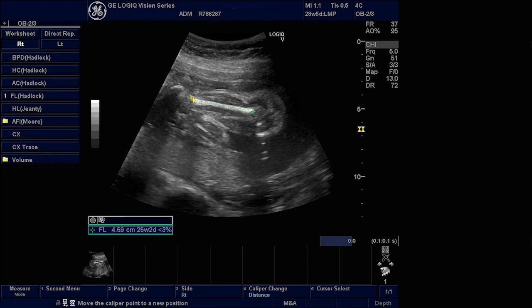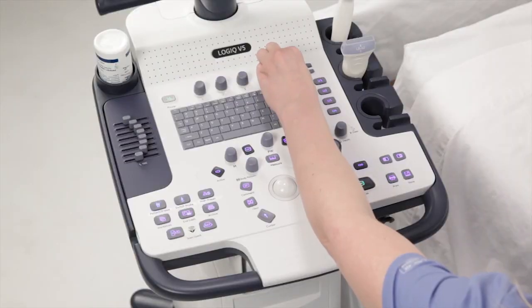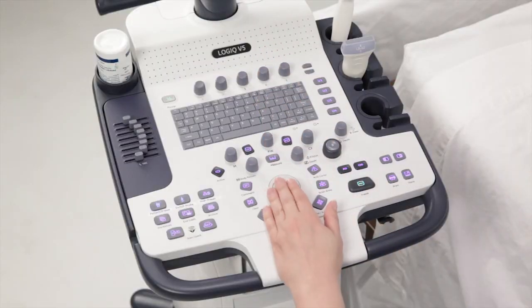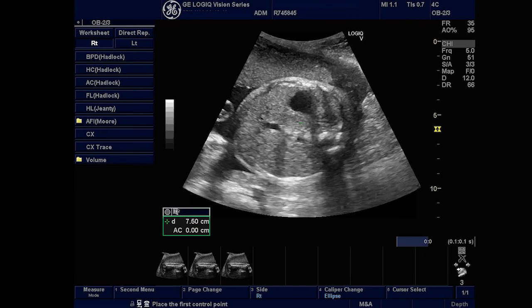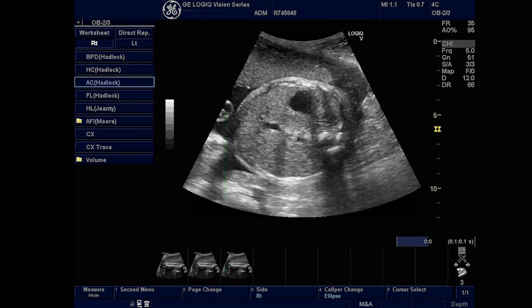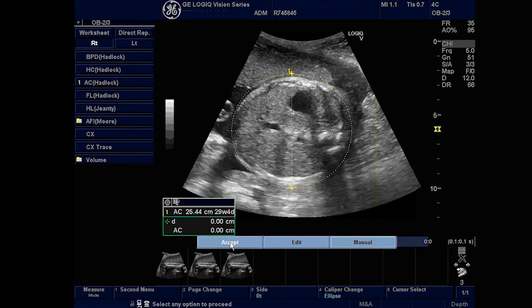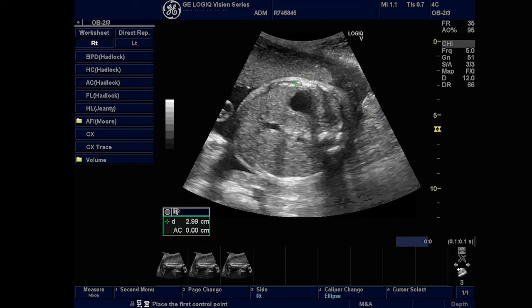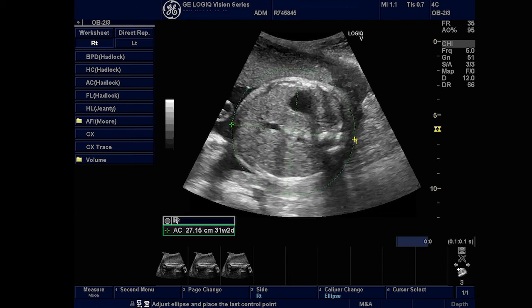The cursor now becomes active and can be adjusted. To toggle between the active cursors, use the Cursor Select option on the top menu. Alternatively, the user also has the option of discarding the automated measurement and proceeding with a manual measurement. To do so, select the Manual option from the menu displayed. By doing this, the auto-measurement clears and you can proceed with the measurement manually.